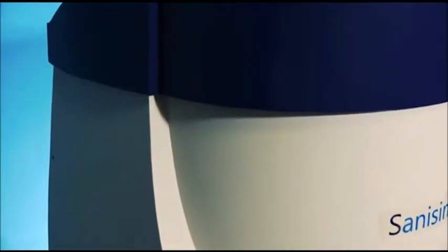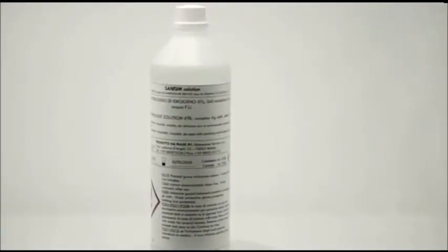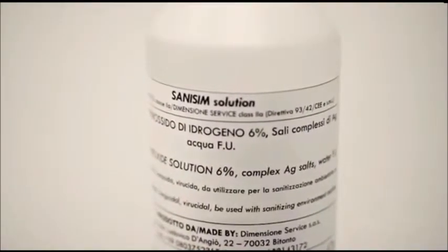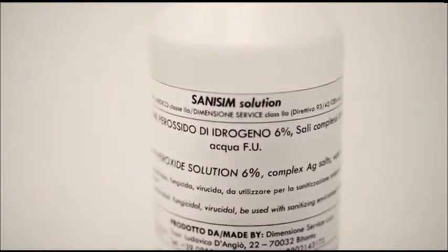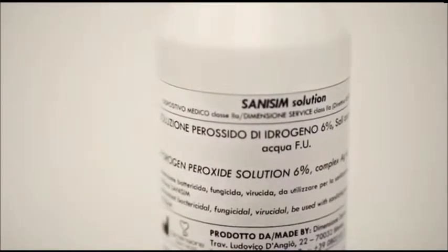Morning. This is a presentation of our SANISIM device combined with disinfectant SANISIM solution. The disinfectant solution is based on hydrogen peroxide with less than 6% concentration with addition of silver ions which have a catalyst effect on bacteria.